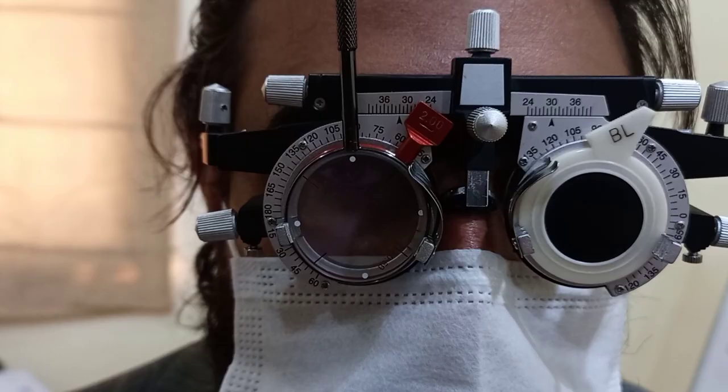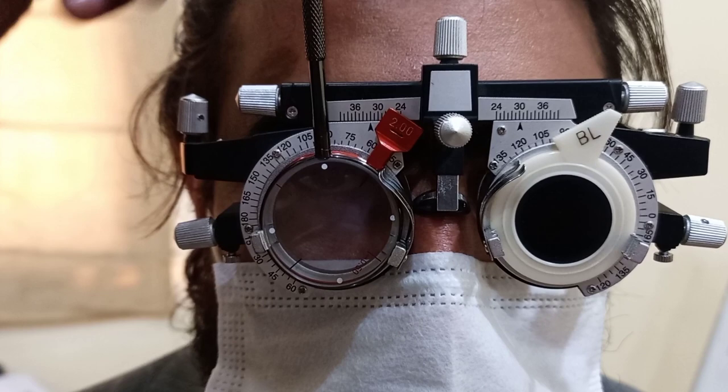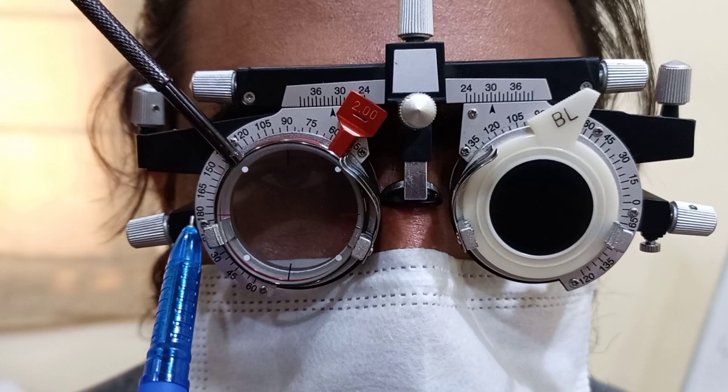Our patient rejected both position number 1 and position number 2 when the handle was at 90 degrees. Now I will place the handle of the Jackson cross cylinder at 135 degrees. With the handle at 135 degrees, the black line of the plus cylinder is coinciding at 90 degrees and the red line of the minus cylinder is coinciding with 180 degrees — this is position number 1.